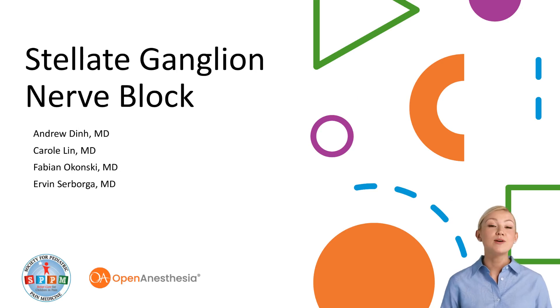Welcome to another visual pearl brought to you by the Society for Pediatric Pain Medicine in collaboration with Open Anesthesia. Today we will be discussing the technique for ultrasound guided stellate ganglion nerve blocks.